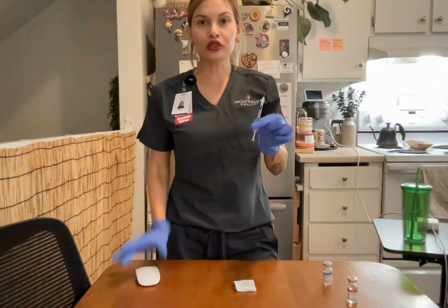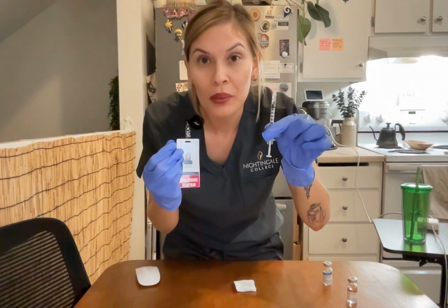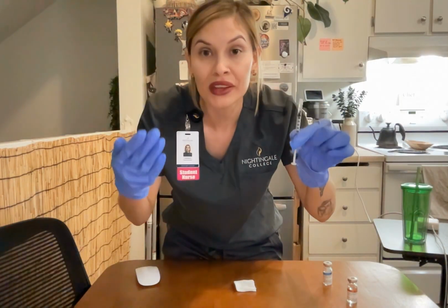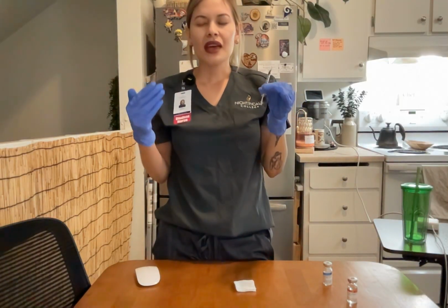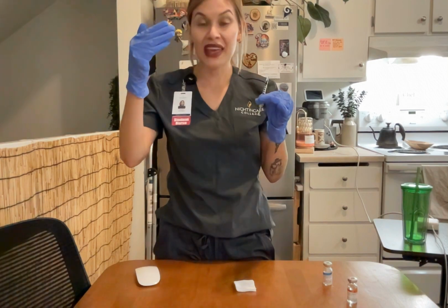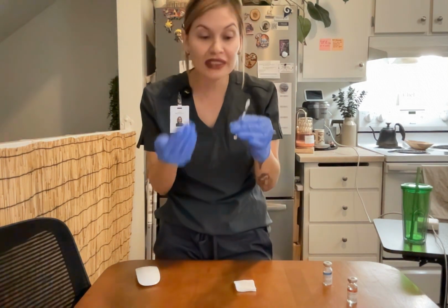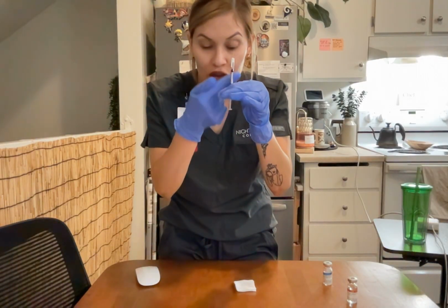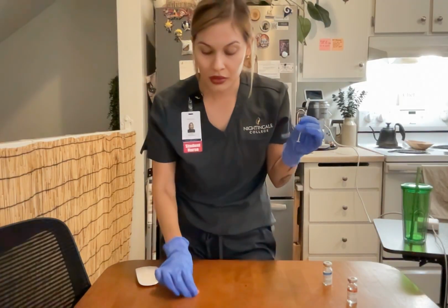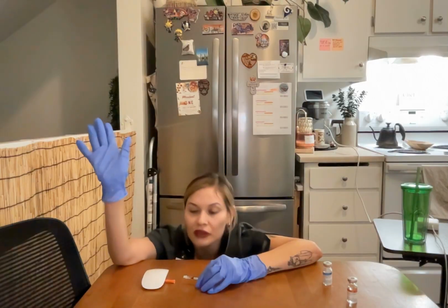Okay, now that I have withdrawn the medication, I recheck again in my EHR or in the MAR that the total combined volume of insulin is 12 units, and again I check my syringe. I make sure that I have 12 units. Now I'm going to recap the syringe using the one-hand scoop method.